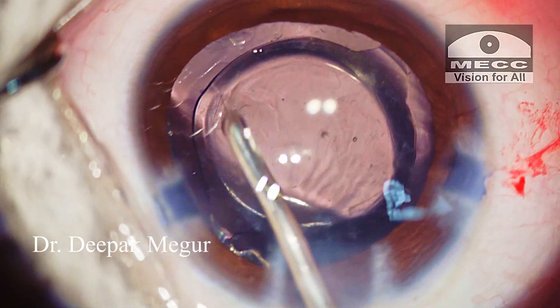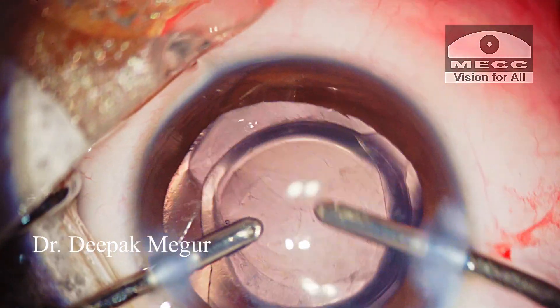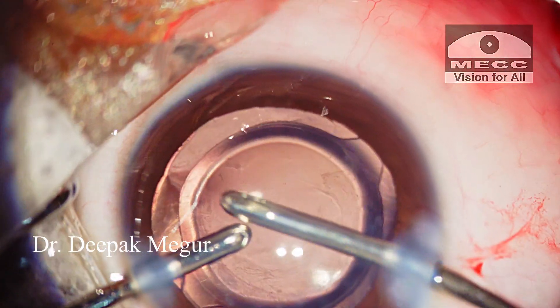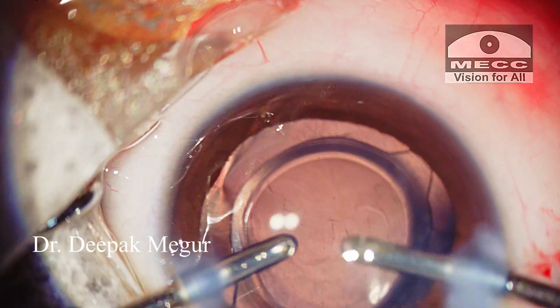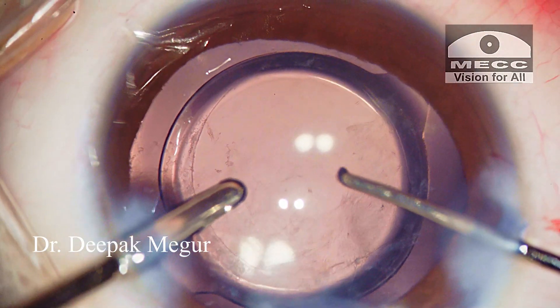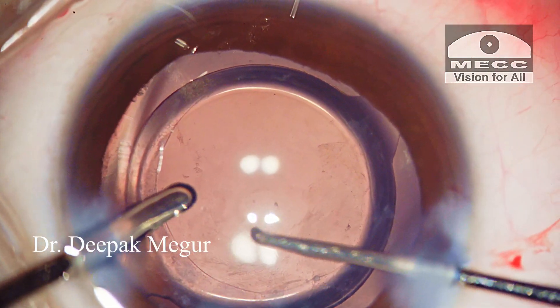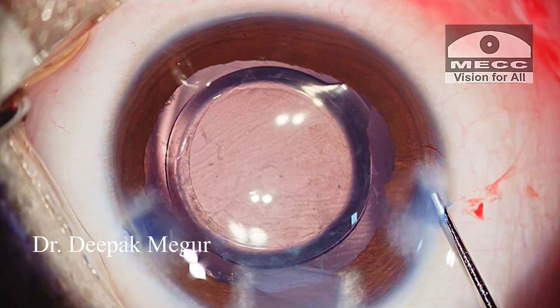The OVD in front of the lens is removed by irrigation. It takes some time to flush out all the OVD. The little bit of OVD which has gone into the Berger's space is left there. Finally, I am just checking the IOL position and centration.